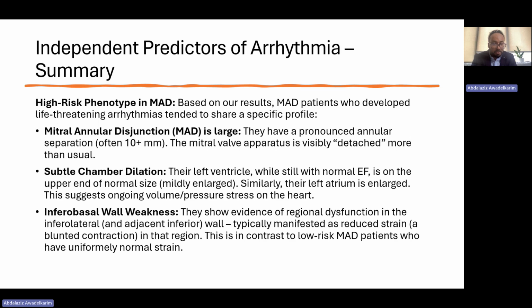So, what's the nutshell of this research? The nutshell of this research is that there are certain specific criteria that, if a patient has MAD on echo, you can focus on to classify and stratify people at high risk. The biggest one is the MAD distance. If it's close to 10 or above, then those people need very close monitoring.